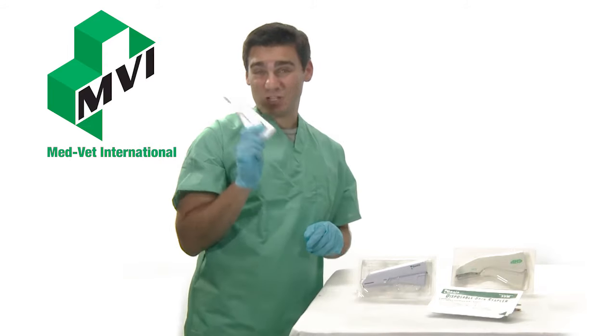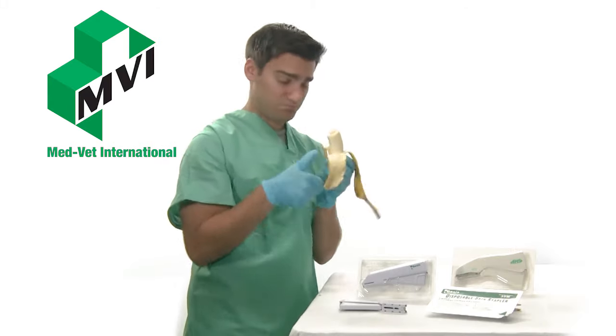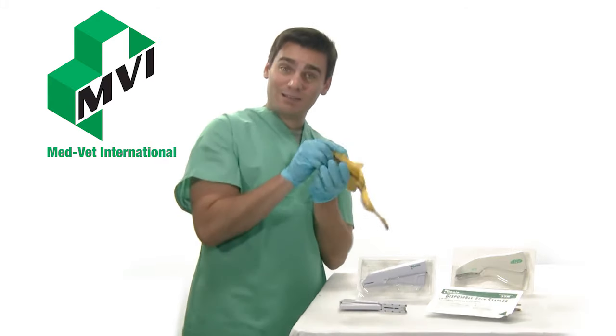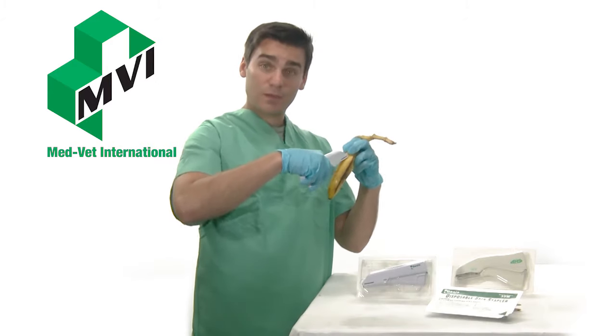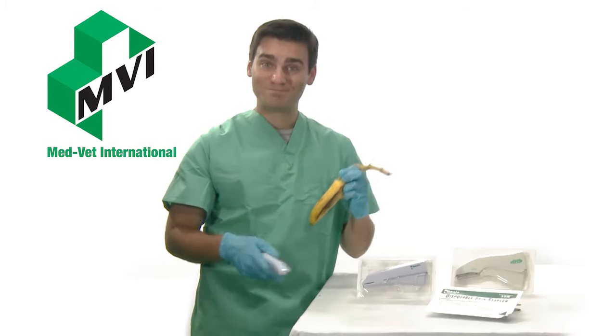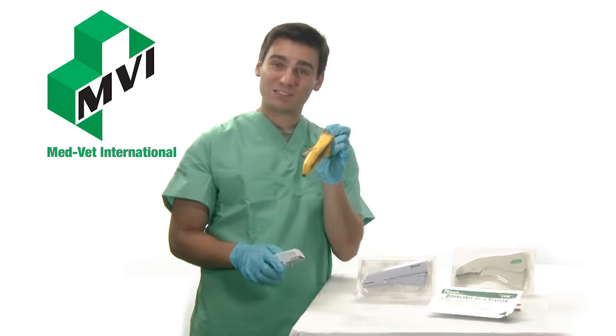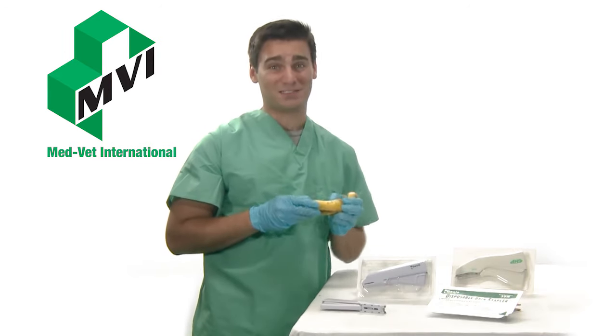These staplers are extremely easy to use. Simply squeeze the stapler over the center of averted skin and release the trigger for a clean and effective wound closure. Quality construction and simple design assures reliable, consistent performance with Oasis and AHS skin staplers.